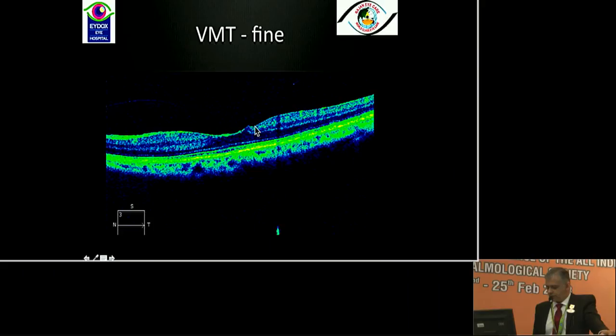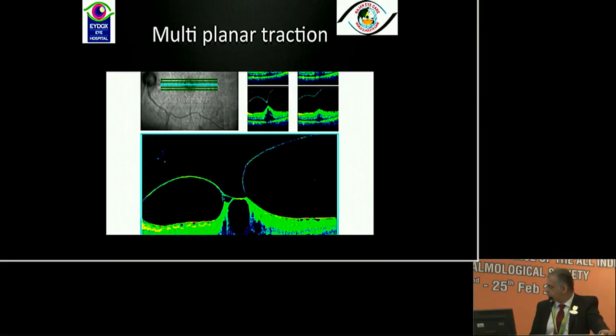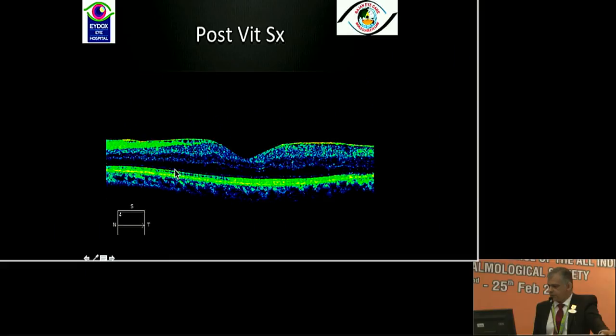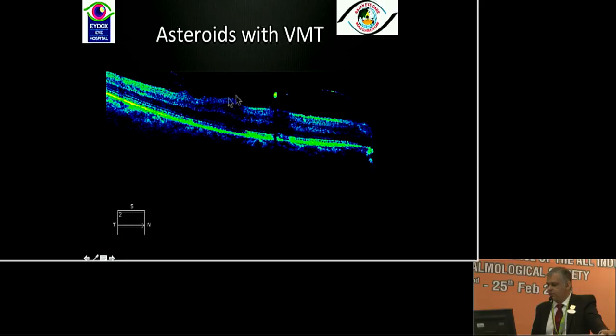Fine vitreomacular traction can easily be missed on clinical examination, so OCT gives us quite good understanding of this problem. This kind of multi-planar traction — from the vitreous to the epiretinal membrane on the surface to intraretinal cysts — and neurosensory detachment of the retina is a clear-cut case for vitrectomy. No way this patient will benefit with pharmacotherapy. Sometimes if the media is hazy you can still pick up foveal status; this patient has a TRD involving the fovea and will require surgical intervention.